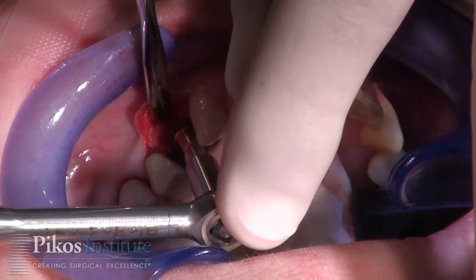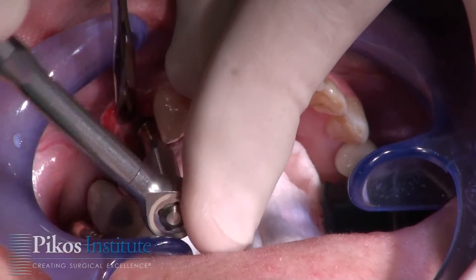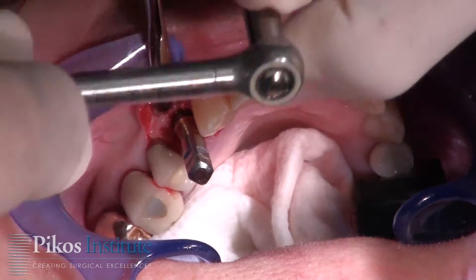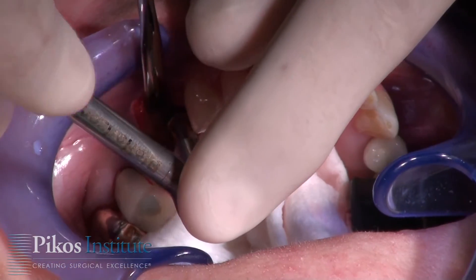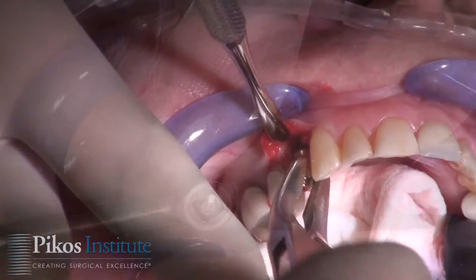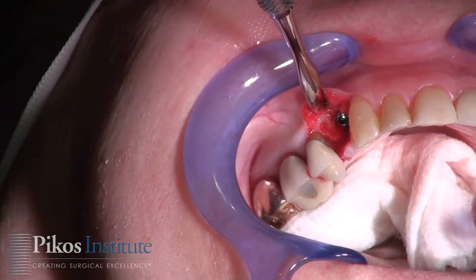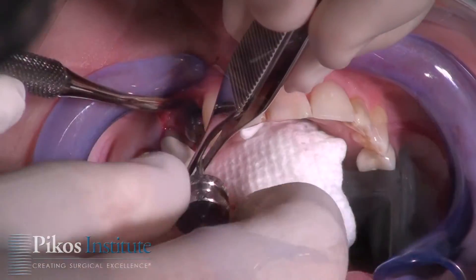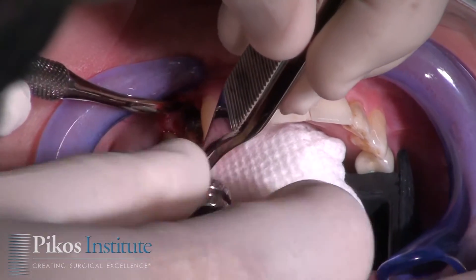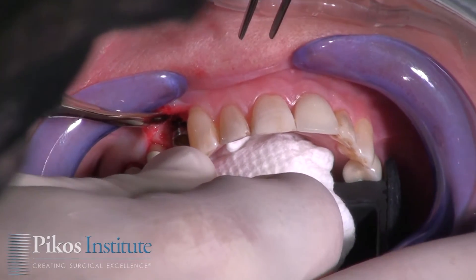This gives me a nice proprioceptive feel for the implant insertion itself. We angled here to the mesial and now we'll just come back in — this is the advantage of being able to manually torque this. We'll take out our 3-in-1 abutment, and now we're looking at placing our healing abutment. This implant will be placed in a non-submerged mode.